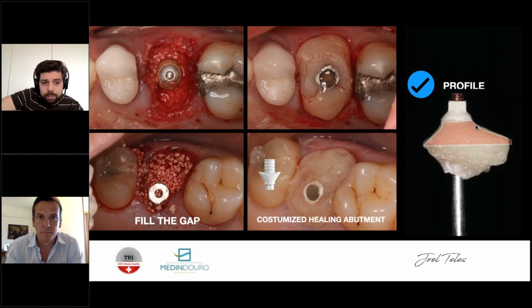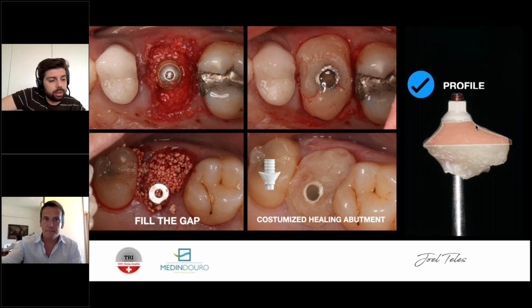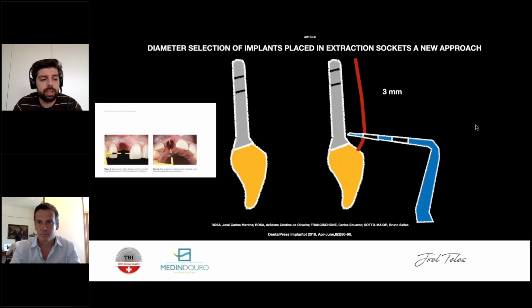If I have sufficient height, meaning it's more likely in a fourth than in a fifth, I will just get that primary stability from the root positioning. If I don't have that amount of bone apical to the root to anchor my implant, then I will do it exactly like you said, using the palatal wall to get that same primary stability. So you are perfectly correct. I do exactly the same thing. Even though I prefer to put my implant, like I told you, in premolars exactly in the middle of the socket. It has to do with the forces and with the long-term results for those implants.